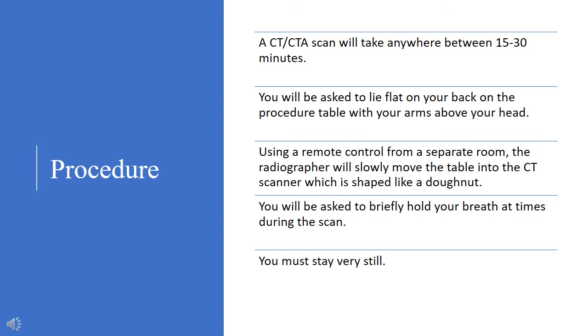The CT portion of both exams will be the same. However, for CTA, you will be injected with a contrast, as previously mentioned. A typical CTA or CT procedure will take about 15 to 30 minutes.